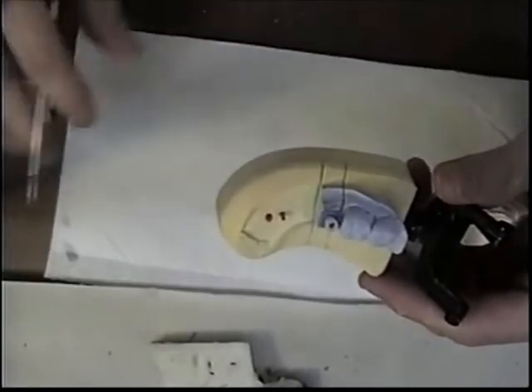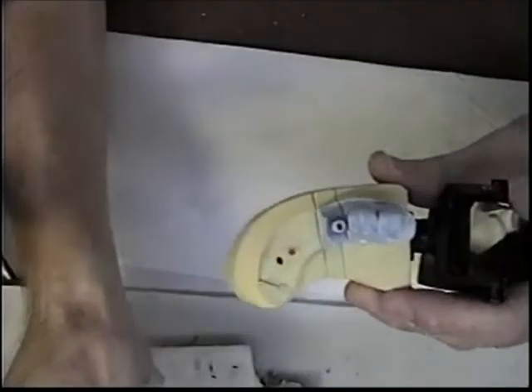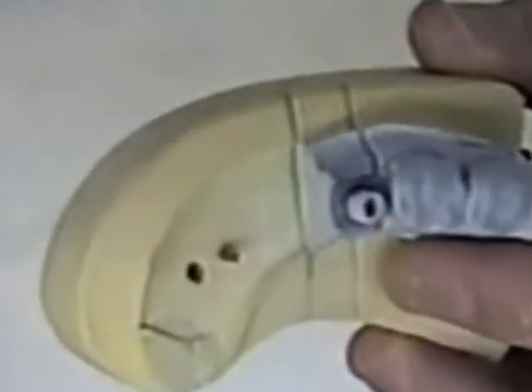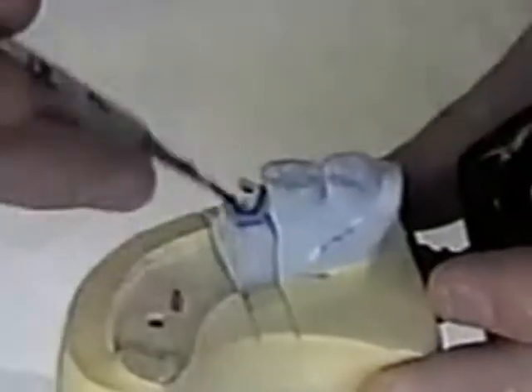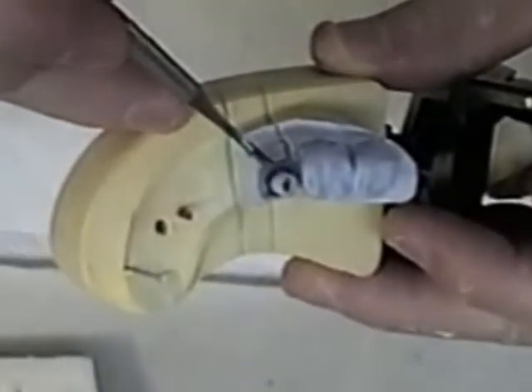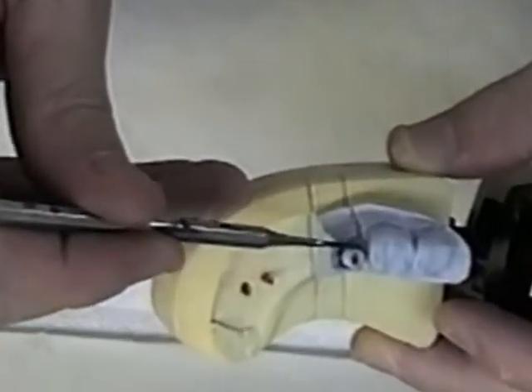So I just flow some wax around the cylinder. I have to make sure that it's hot and flows down to the base of the implant as best I can. And if I get any over the tissue area I can always carve that back later. I just want to make sure that my instrument goes down close to the base of the implant abutment.